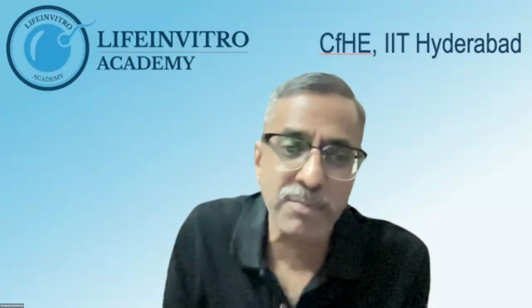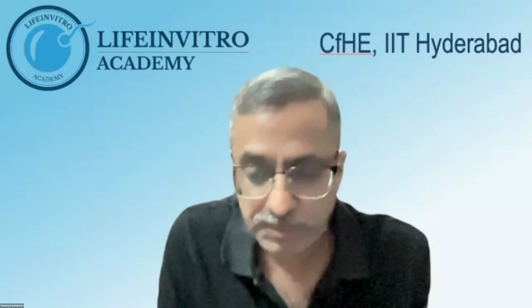So I think a new kid on the block is NIPGT, and I would want your comments on that. I know there have been issues in Australia about NIPGT. And if at all you have some experience with blastocoel fluid analysis or spent media analysis vis-a-vis biopsy, even though we know that the gold standard happens to be the trophectoderm biopsy.